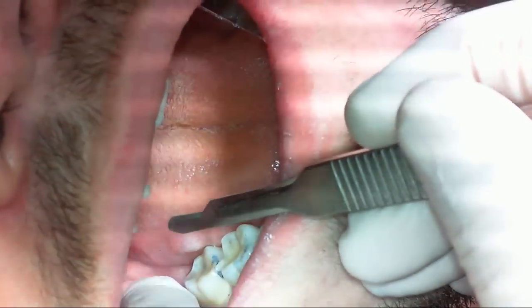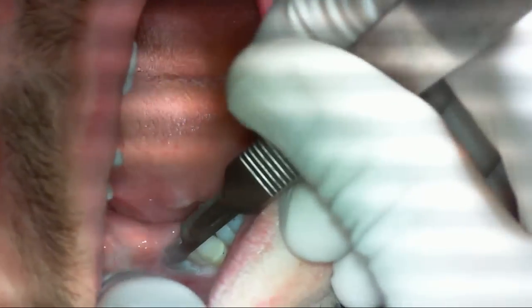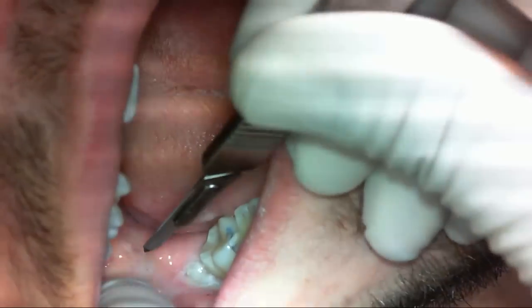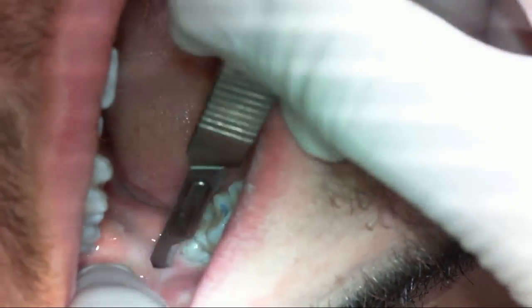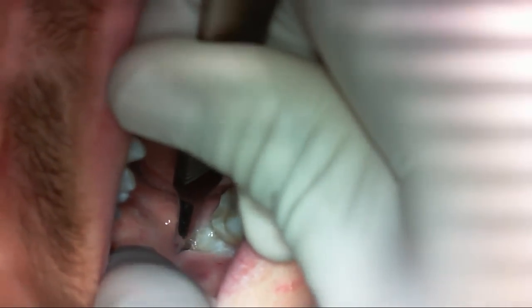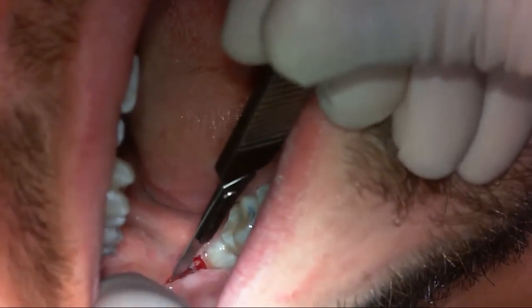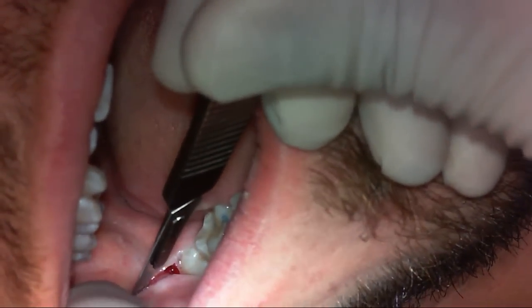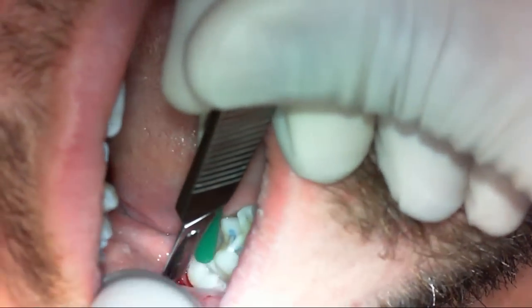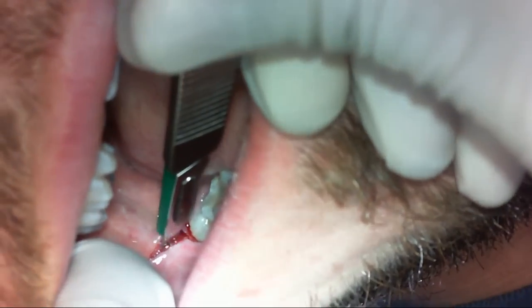When doing my initial incision, with my left index finger I'm feeling the external oblique ridge. Your blade should always be resting on bone so you know how deep it's going and where it's going. If it's not resting on bone, you risk going into the lingual space and cutting the lingual nerve. As we know, in 15% of patients the lingual nerve loops a little high on the gum.